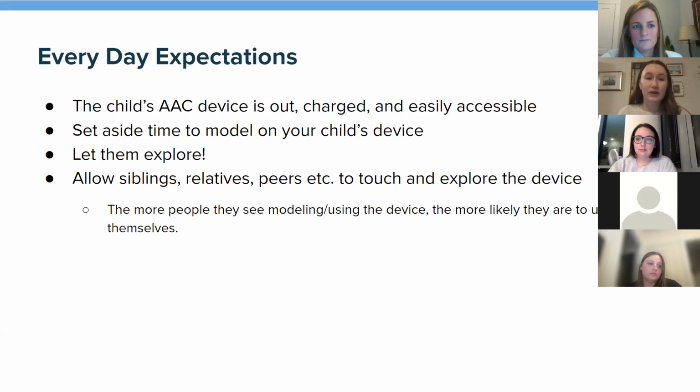Let them explore their device. This allows them to get to know the device better and hear it, give it a try. And just like we respond to verbal communication or babbles or sounds from children, we can respond to these words that our kiddos are producing as they are exploring their devices and kind of create conversations around them. Let them know that we hear them and that we hear this device as their voice as they're exploring.